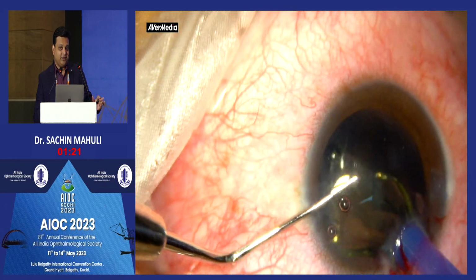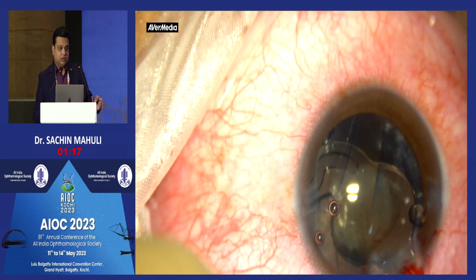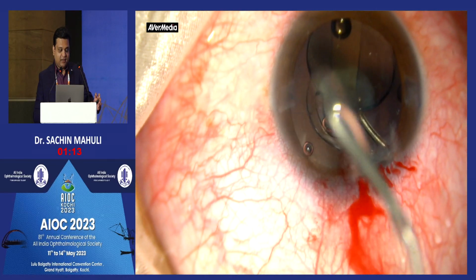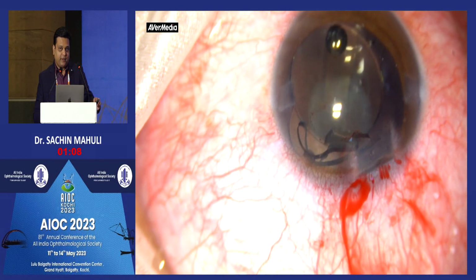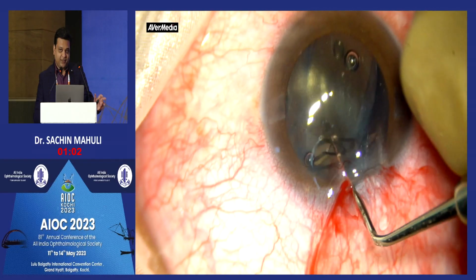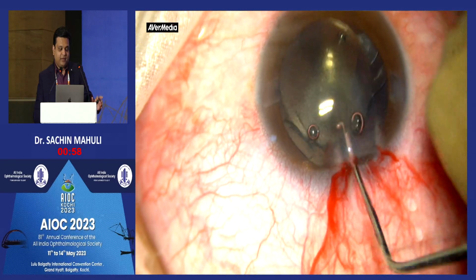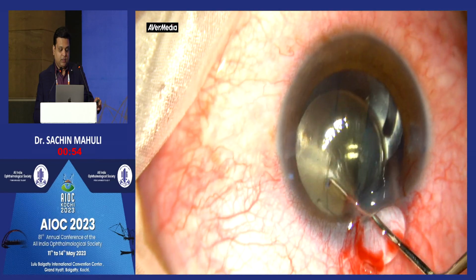It is not necessary that this patient would have had a lens touch; even without a lens touch, these plaques are pretty common. Handling these plaques is challenging because intraoperatively you either have to do a primary posterior capsular opening with your needle or with the cutter, or you can do a capsulotomy later on in the postoperative period. Unless this is removed, whatever retina surgery has been done, the vision won't improve as expected.